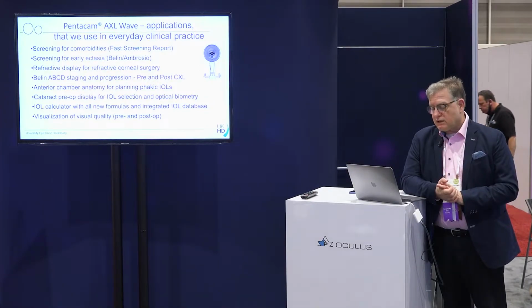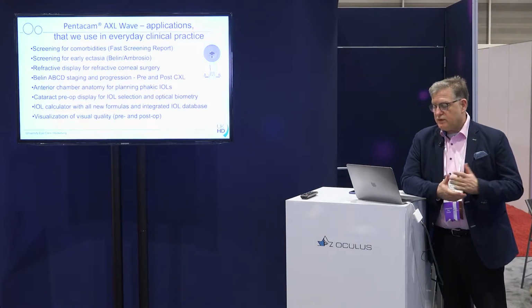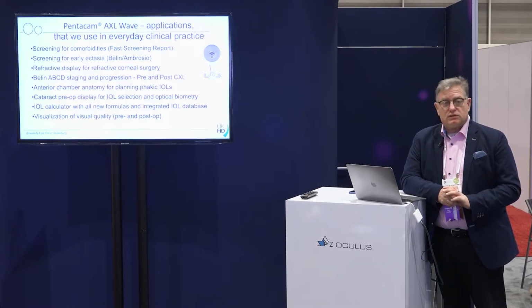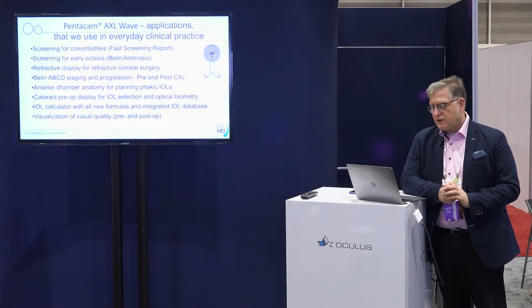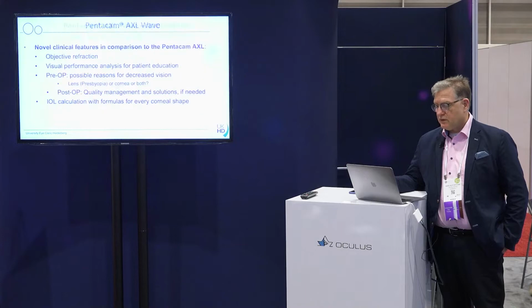There are all kinds of IOL formulas implemented in the system, and you have an integrated database where you can also fine-tune your data. And then there are some interesting tools which we can use for the patients to explain them if there are some issues with their vision quality, and we can quantify that.